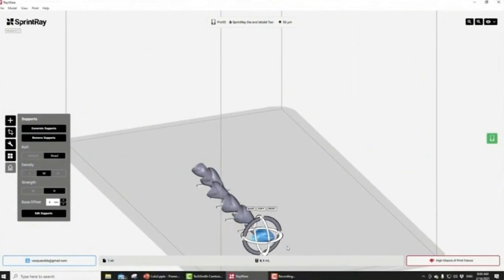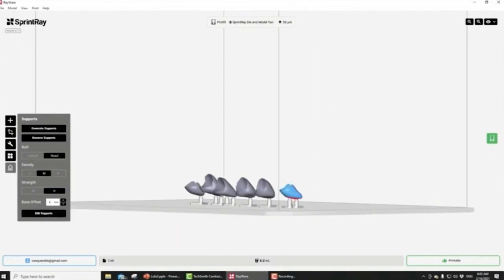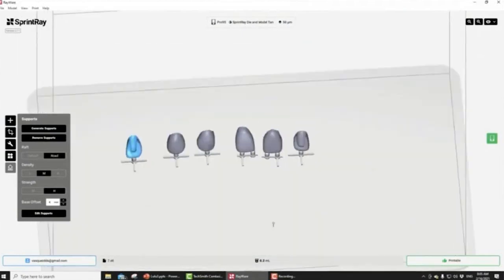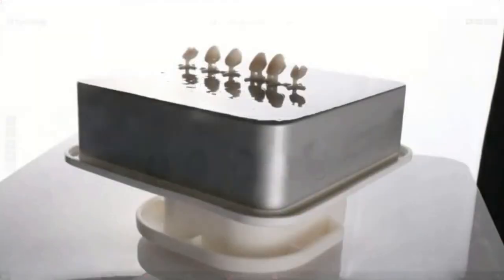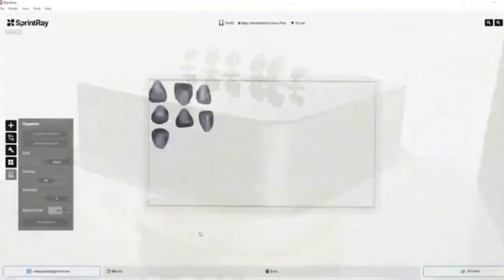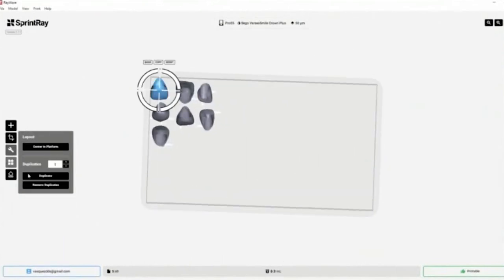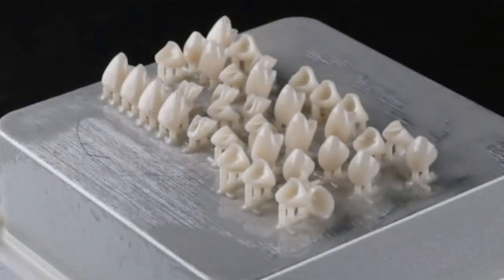I'm going to send all my restorations to the printer. How long is it going to take to print? It's going to take about 35 minutes. Now, what is the difference between printing 6 restorations, where I can fill the plate completely, or I can just say I want to mill multiple restorations? It's going to take the same time. Okay, I was just playing.